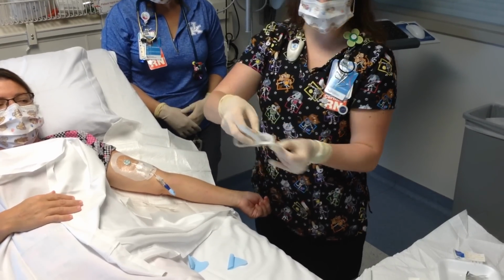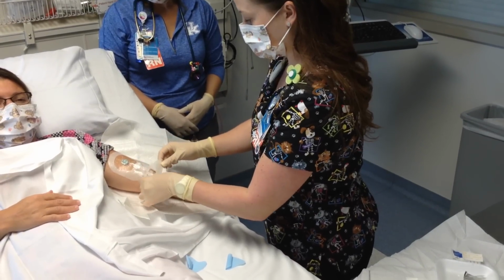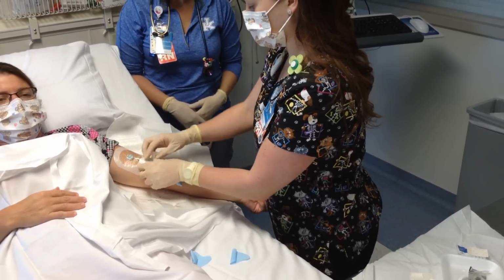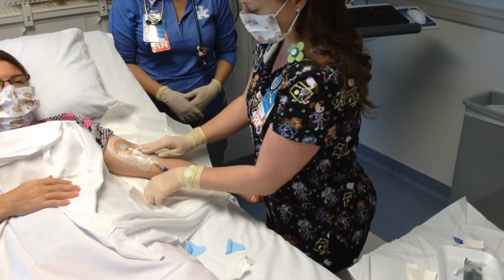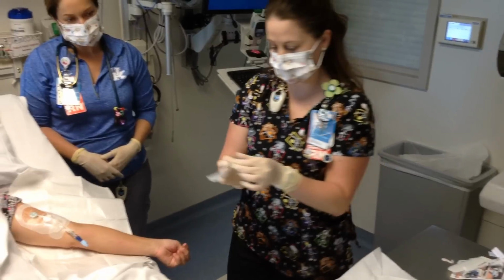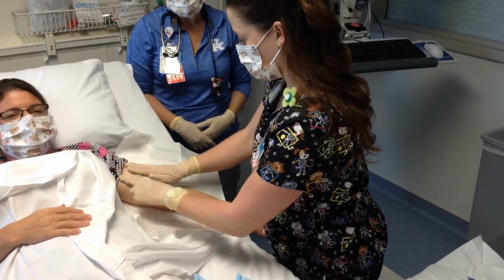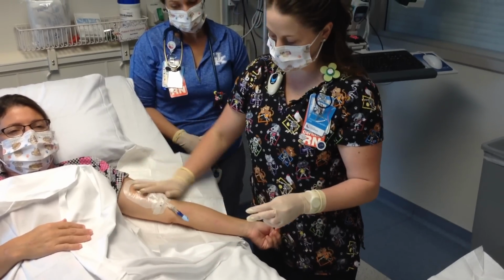Your bottom piece then goes on. This as well goes up under your catheter and lays all the way up and flat down. No need for a chevron the way this dressing is designed. Again, using the warmth of your fingers. Then you would date and initial your label piece. This goes right over top as your closure method. And also afterwards make sure that you document your dressing change on your flow sheet in Epic. Then your dressing is finished.